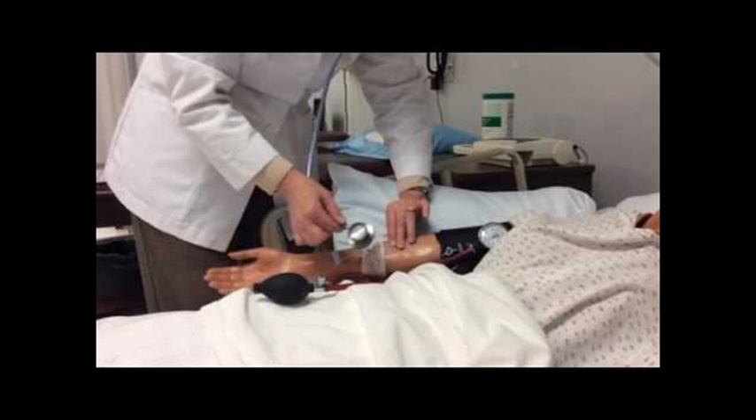Step 07: Now that you have a rough value, the true value can be measured. Place the diaphragm of your stethoscope over the brachial artery and re-inflate the cuff 20 to 30 millimeters of mercury higher than the estimated value taken before. Then deflate the cuff at 2 to 3 millimeters of mercury per second until you hear the first Korotkoff sound — this is the systolic blood pressure. Continue to deflate the cuff until the sounds disappear — the fifth Korotkoff sound — which is the diastolic blood pressure.